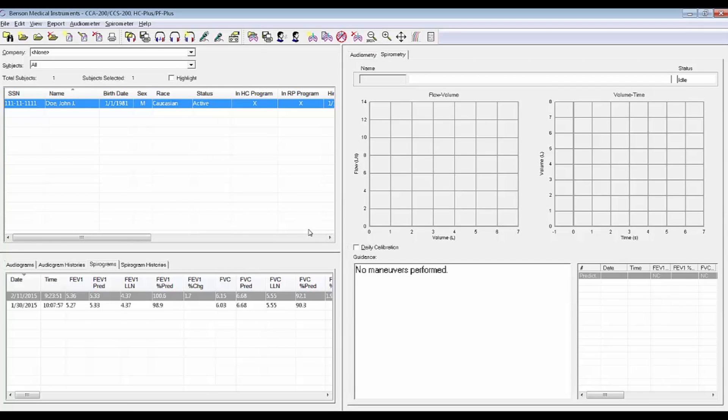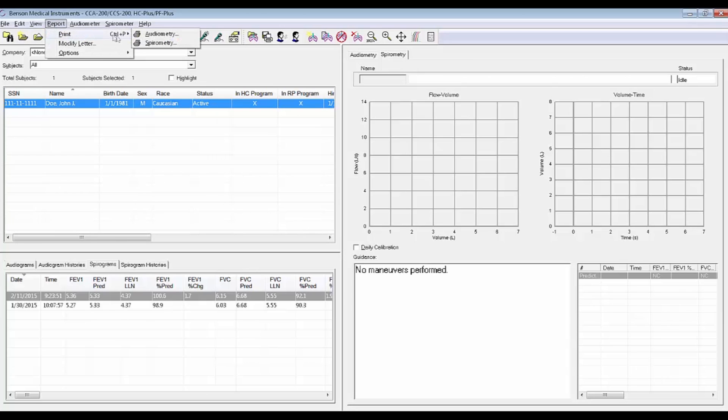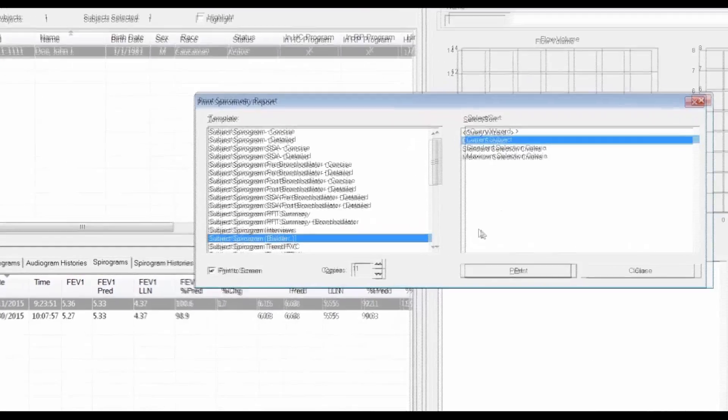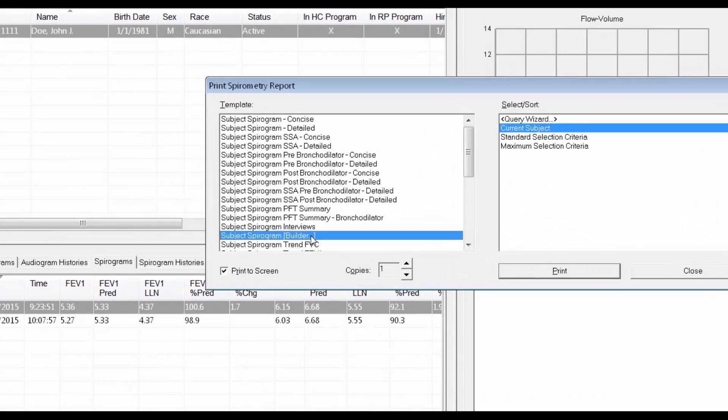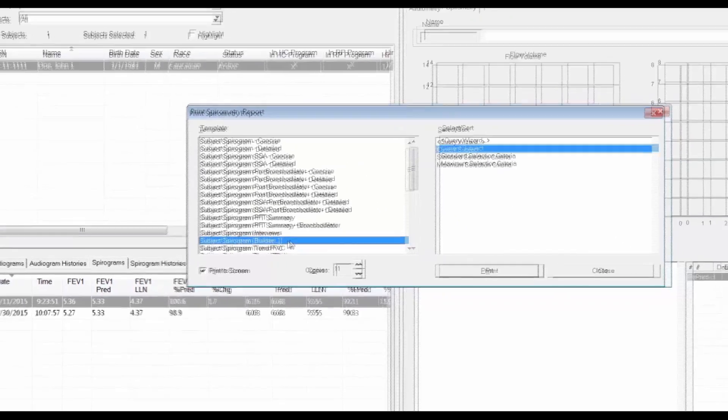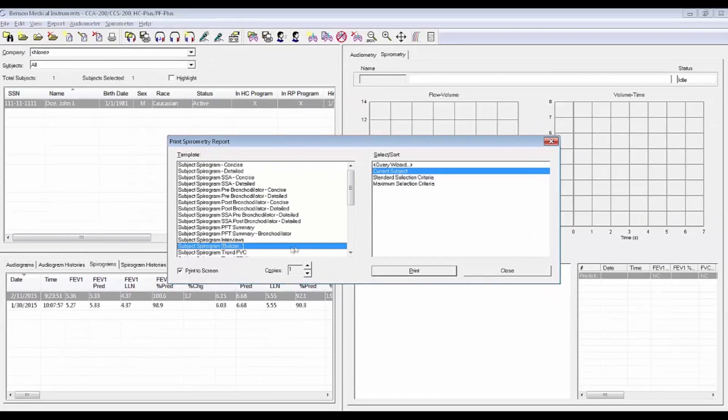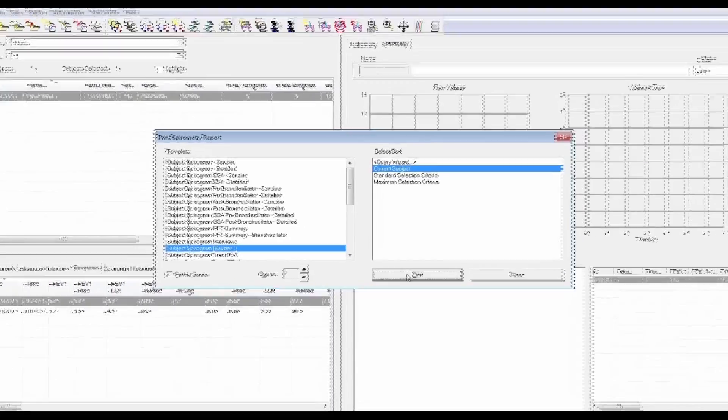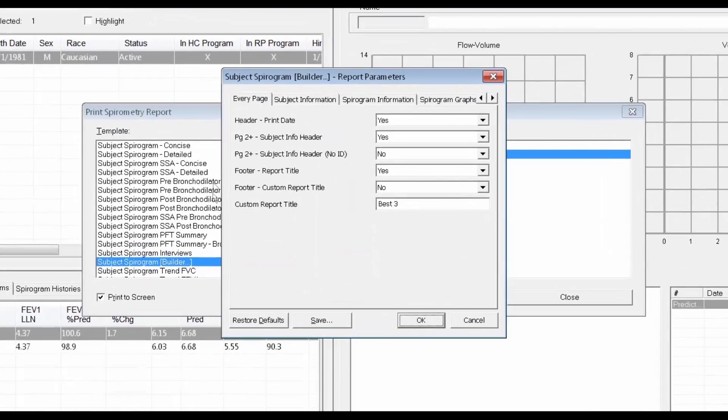Now we know that the CCS200 Plus can display graphs on reports any way you want. These choices are made in the Report Builder feature. We won't go over all the features of the Report Builder in this video, just how to select graph options for a new report.